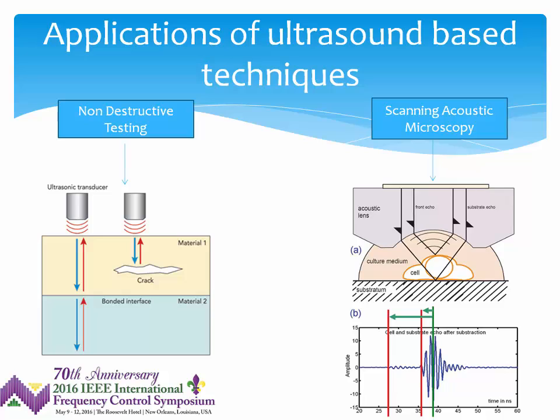There are some advantages here in terms of the way ultrasound essentially interacts remotely with materials, and that allows you to obtain some interesting characterization of material properties and differences in material properties that are probed over length scales that could range anywhere from submicron to macroscopic.